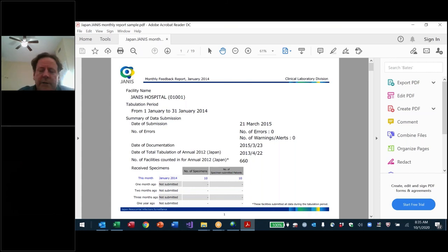Let's see, Sri Lanka also has a web-based system for public health surveillance. It's not DHIS2. And he said, John, we're very good at SQL, we're very good at the web system. Can you help me with WHONET and how can we integrate it? So basically they already had web-based systems and they incorporated, or are incorporating, WHONET into it. So it's most practical if the expertise already exists to do this, because you're just adding another module to it.